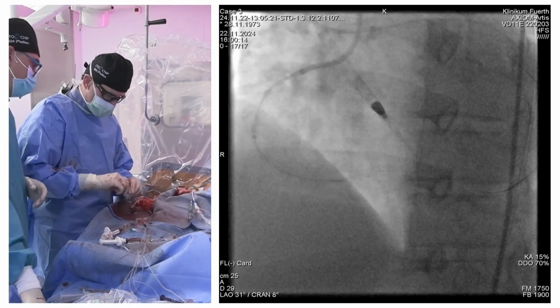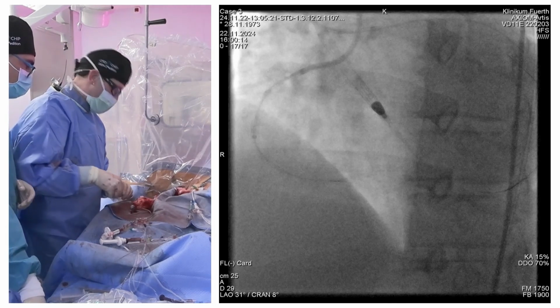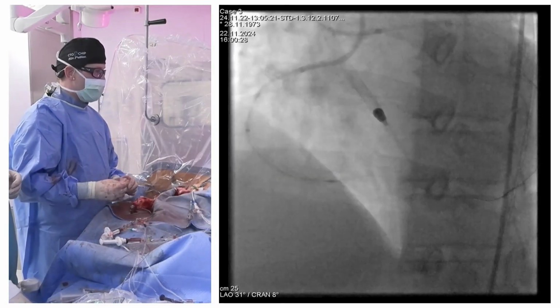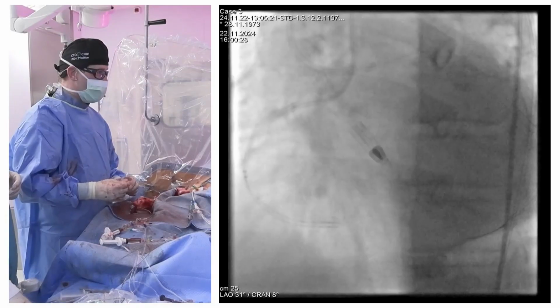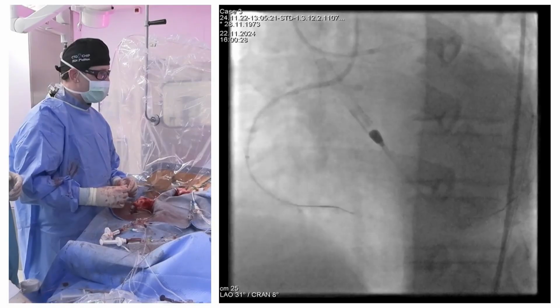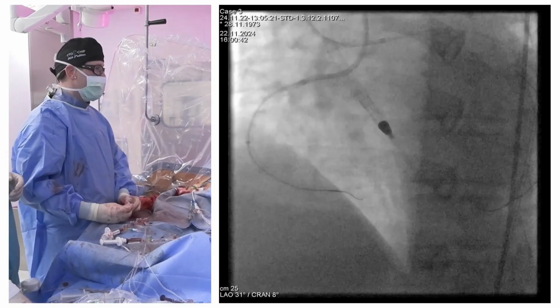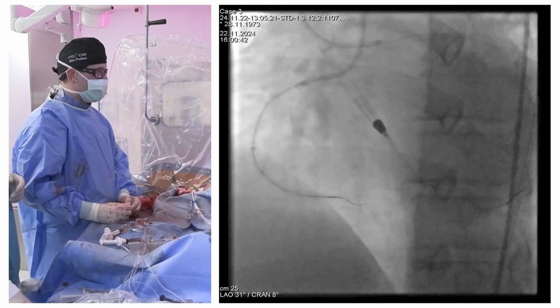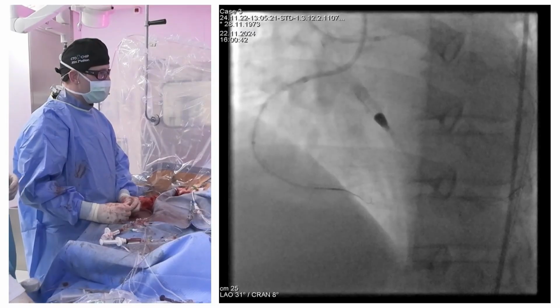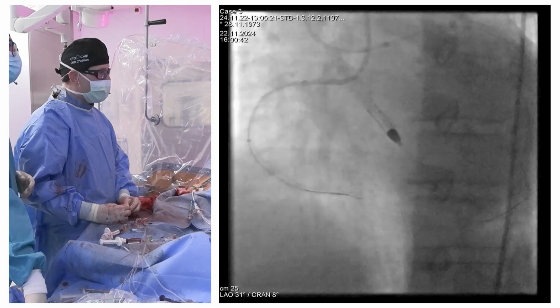The beauty of the Gladius, especially in stent and bypass CTOs, is that it has more or less a round tip, so it does not tend to go under the stent, even though we have experienced this in every part of this long stent area today. So I'm not entirely sure if it's going to be very helpful. Right now we have probably left the stent part too. It's just going too well.